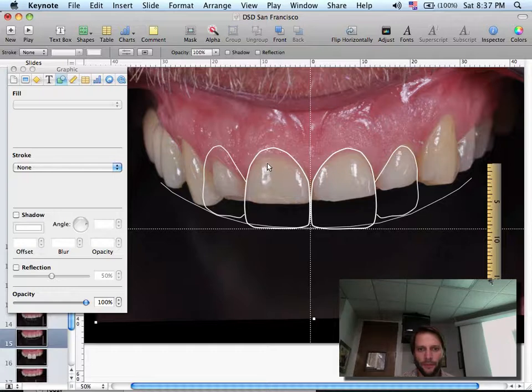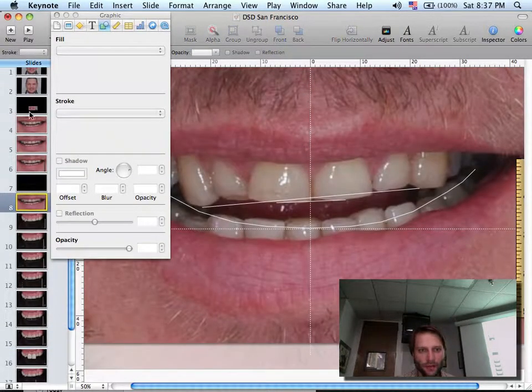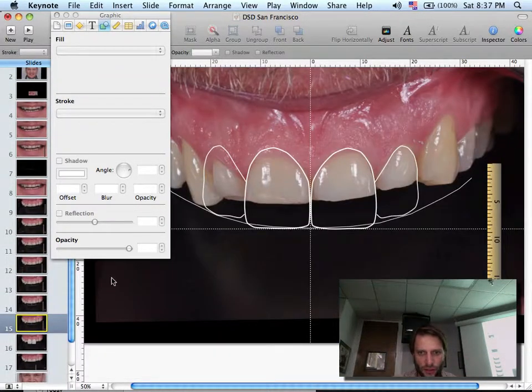Here, what we do here, I can check the probing, see what are the consequences of playing with the soft tissue over there, and I can come back to the face photo. If the centrals were not important, because they don't show the lateral, for me it's important because he doesn't show soft tissue. He shows more soft tissue in one lateral than the other, and that really doesn't look good. So I can show this to him and say that here maybe it's nice to reshape and to match the other side.